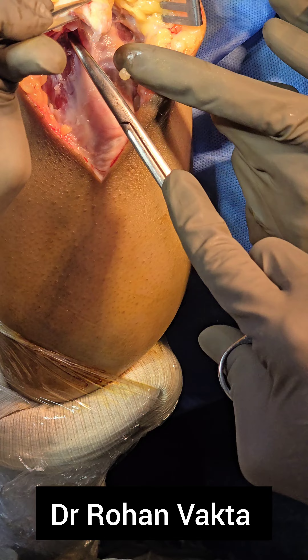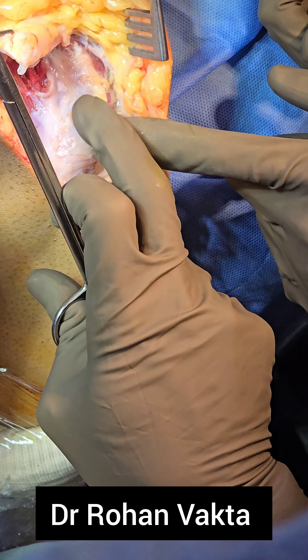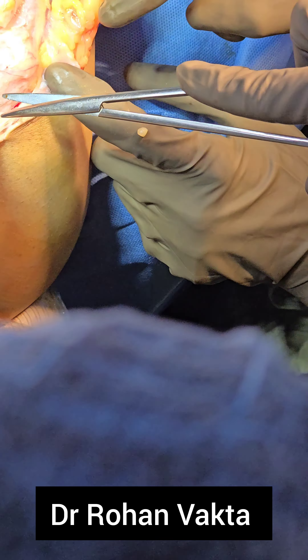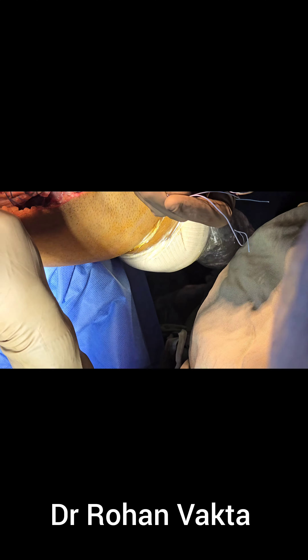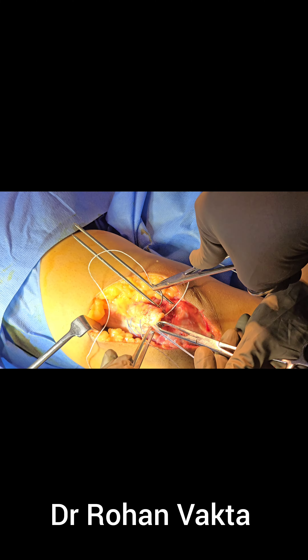As you can see, the margins of the triceps are not very good. All the fibrous tissue is removed and the remaining triceps tissue is detached away from its insertion at the olecranon process. It is mobilized, all the fibrous tissue is removed, and the olecranon bed is prepared. All the fibrous tissue from the bed is excised.